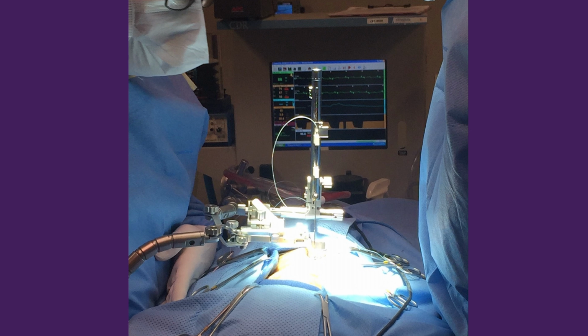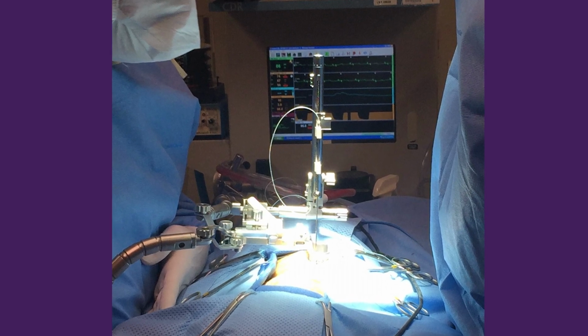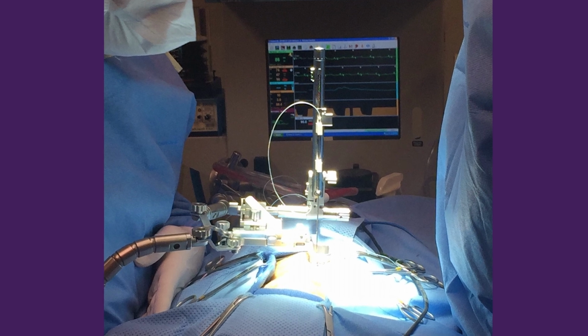After we had decided what the device was going to require and need in the general design, we executed upon that design and took the various elements through the appropriate verification and validation protocols. And in this instance, it was processing of the reusable components to determine that they could be sterilized and reprocessed. Then we took all the outputs from the verification and validation activities and compiled them into a design history file that was provided to the FDA as a part of a device and drug filing that enabled clinical studies.